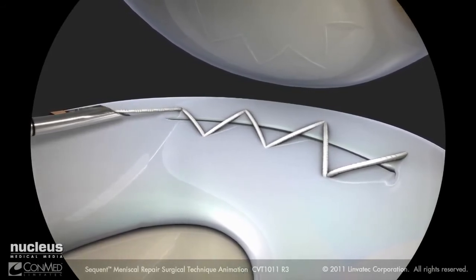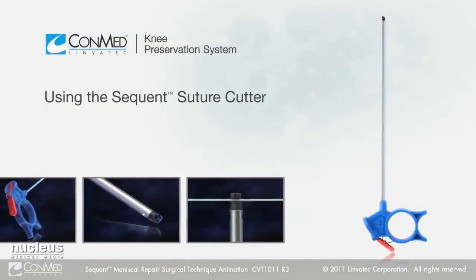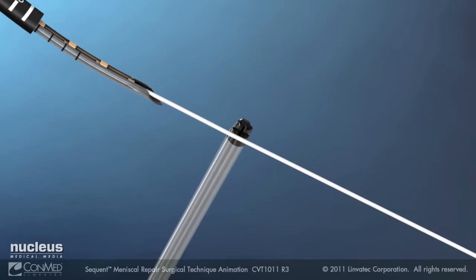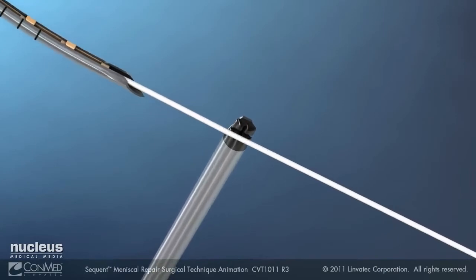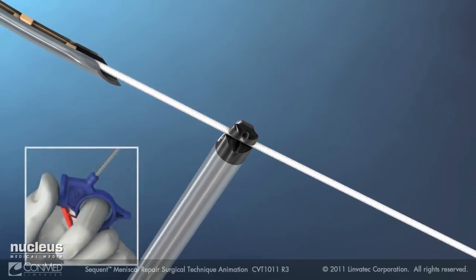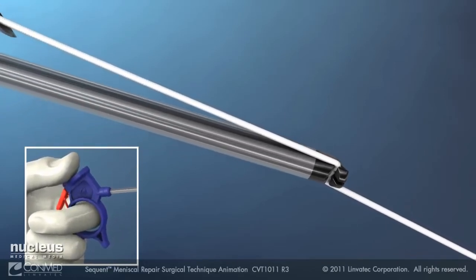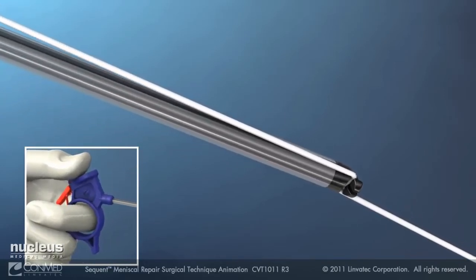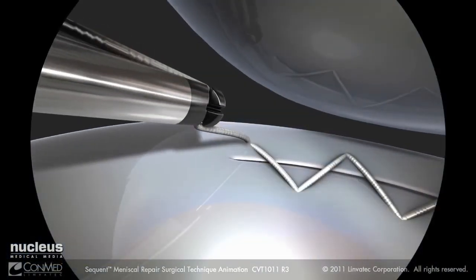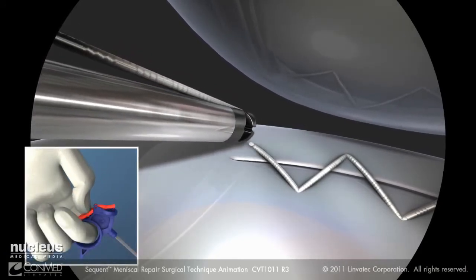After the last stitch, remove the sequent meniscus repair device from the joint. Load the suture cutter onto the suture outside of the joint. Holding the cutter perpendicular and the suture taut, load the suture into the cutter slot. Rotate the cutter shaft to align axially with the suture, keeping the thumb resting on the blue thumb rest. Keeping the suture taut, slide the suture cutter down the suture and into the joint until flush with the meniscus. When ready to cut the suture, press the red lever.